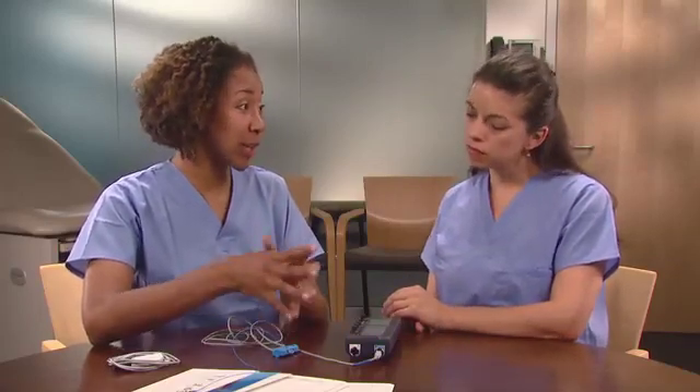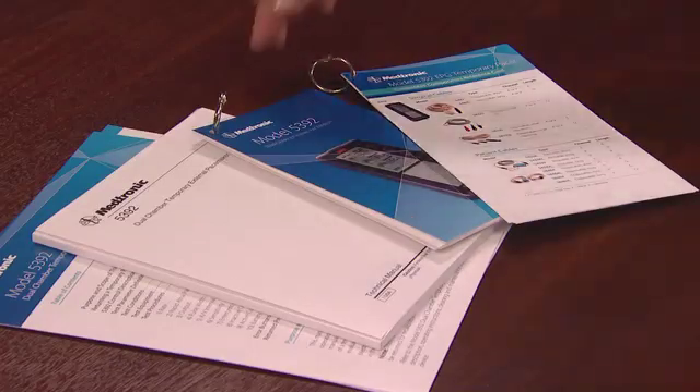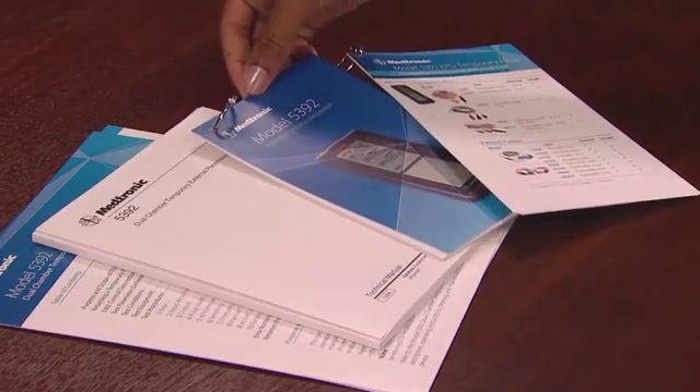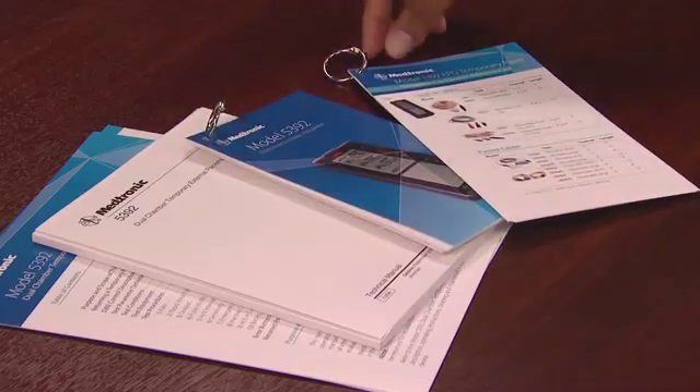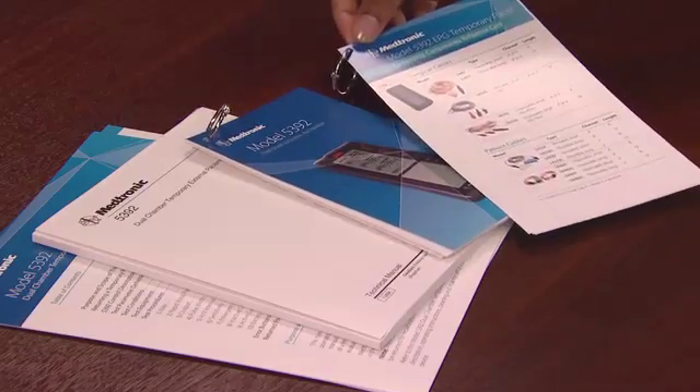While the device is in use with a patient, Medtronic recommends checking the battery status regularly. Also, remember to replace the batteries for each new patient. There are two additional resources: first, the 5392 Quick Reference Tip Card for basic operation, and second, the Compatibility Guide for a listing of all compatible leads and accessories.